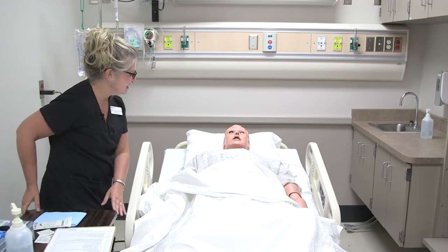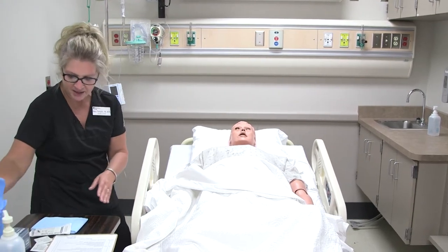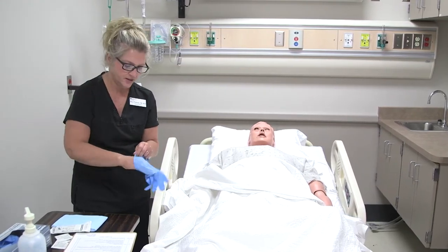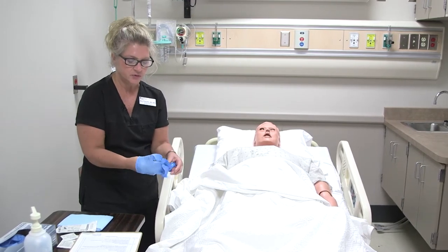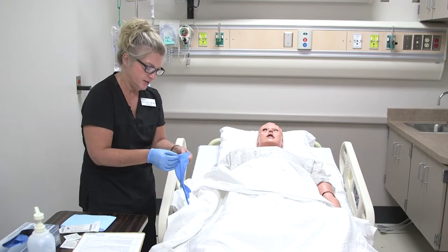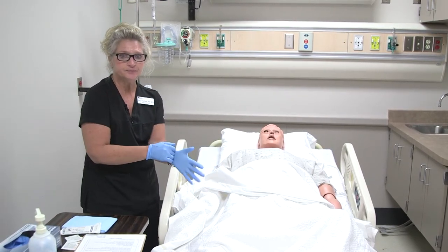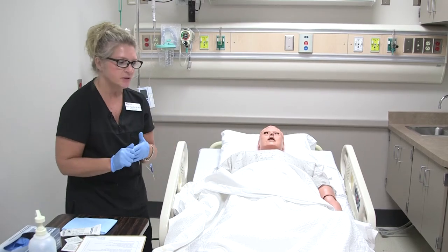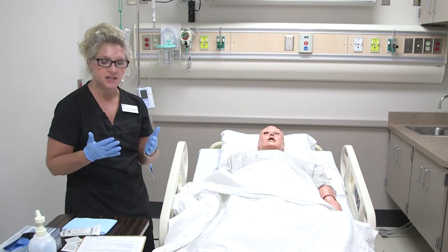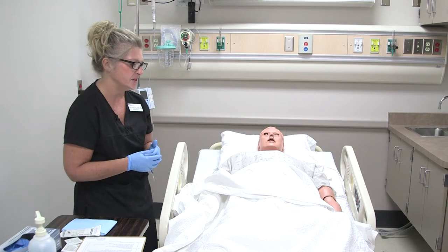It's not going to be as bad as it was going in, so that's good news. I have all my equipment here, and I did verify the order from the provider that we can remove the Foley catheter. We've already performed peri care or Foley care — you always want to do that before you remove, and always after removal as well, to keep bacteria levels down so we don't introduce that into the urinary system.